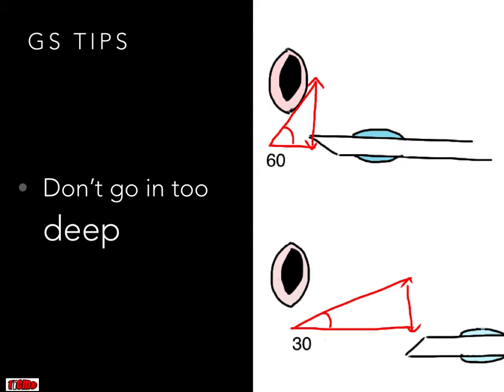If you've got the tube in so that you can see the tip of the tube, remember it will now be on the camera of the Glidescope, and you're trying to move it anteriorly. The closer you are to the cords when you try and move it up and anteriorly, the more angle you've got to adjust the position to get it in. If you withdraw your Glidescope and withdraw your tube, moving that tube up so that it progresses into the cords requires much less of an angle change, so you're not having to apply any force.